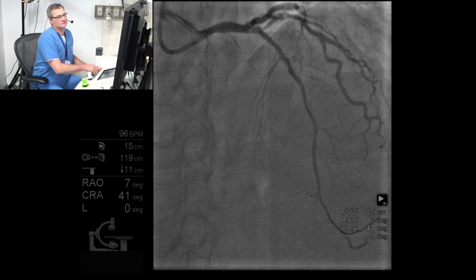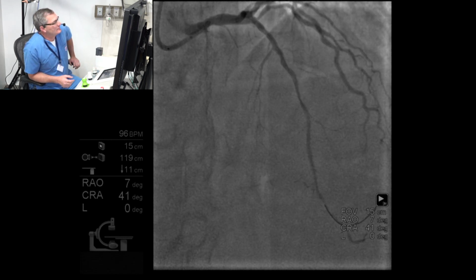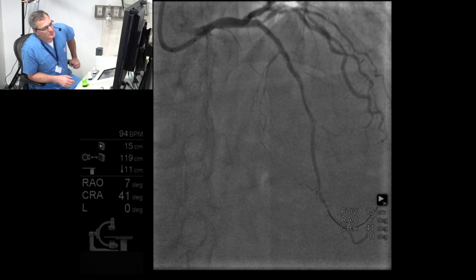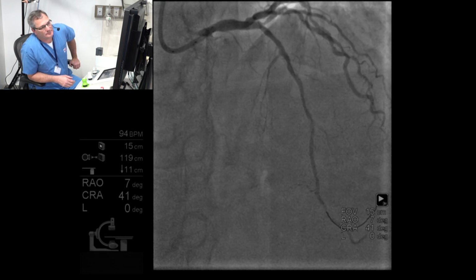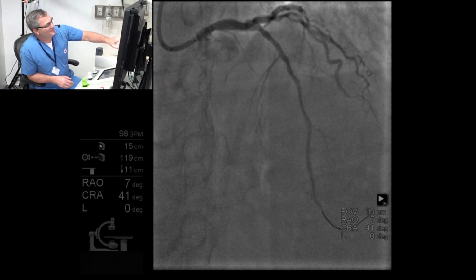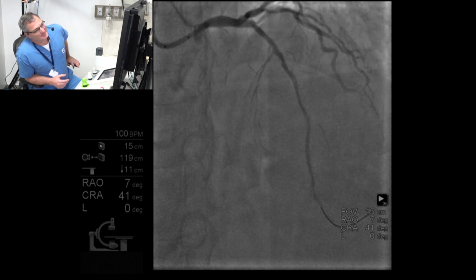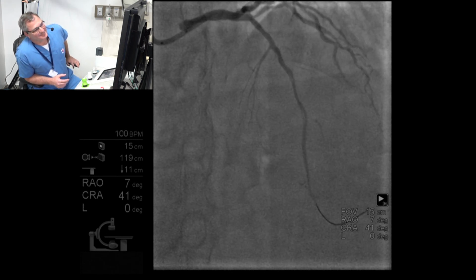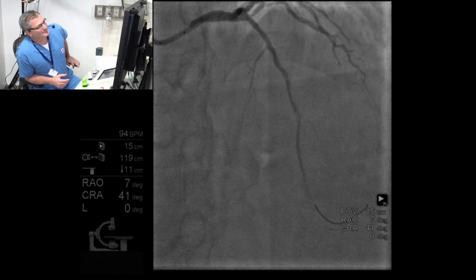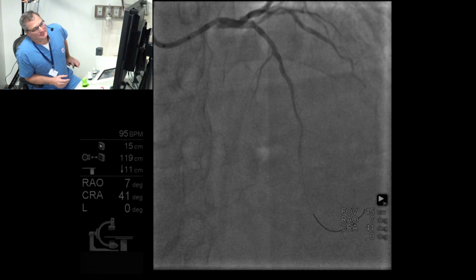Which stent size will you use? I'd like to go with at least a 2.75. Oh, 2.75. Yeah, for the mid part. This is an Indian artery. Do you think that's too big? If you ask me, I will use a 2.25 stent and inflate it at high pressure. And whatever I want to do, I will do with a quarter size higher balloon inside the stent.